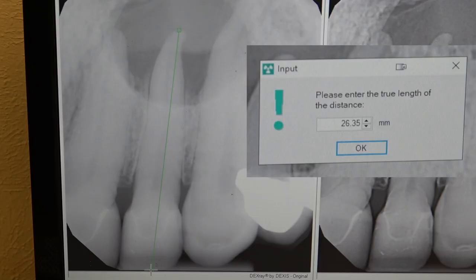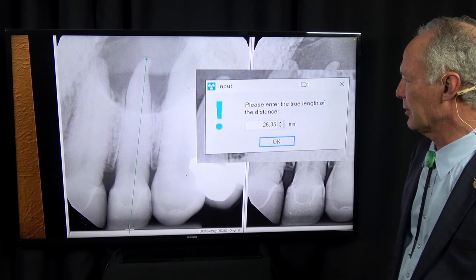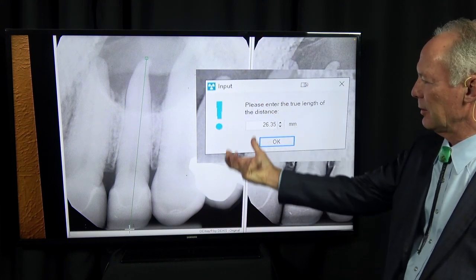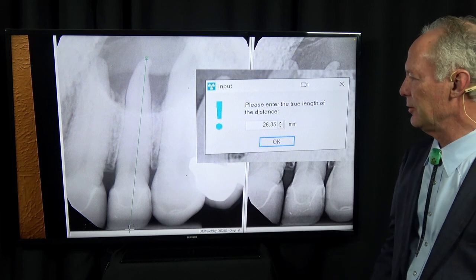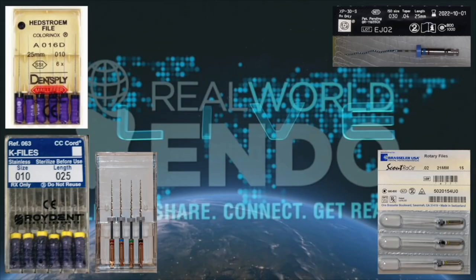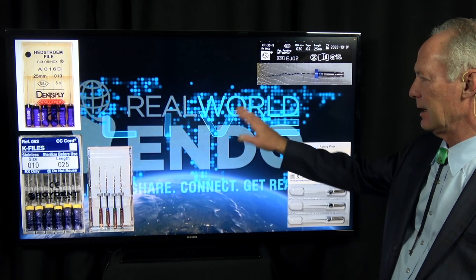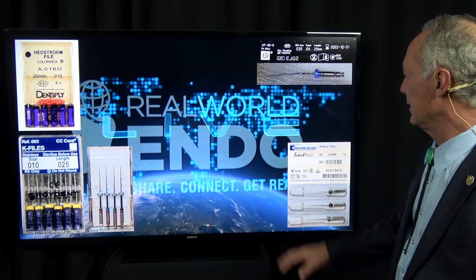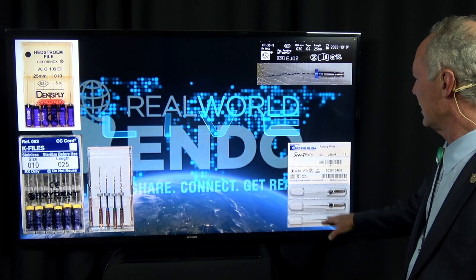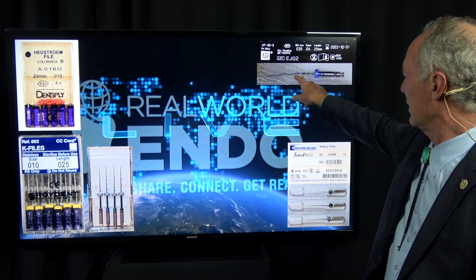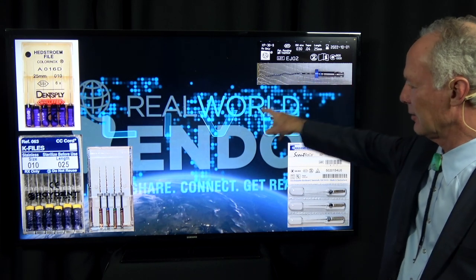I'm irrigating with three parts water, one part sodium hypochlorite, and I would expect some periapical exudate to come through the canal once we open it. You can see it's 26 millimeters. I love the Real World Endo system — these are the different parts: the Scout file and the single file for the complete endo.